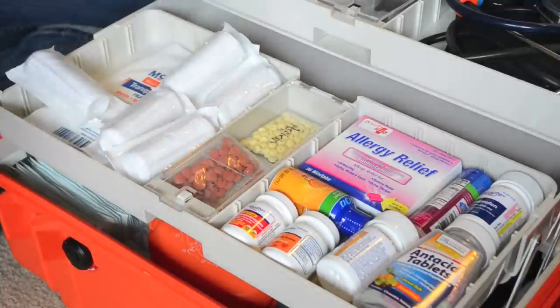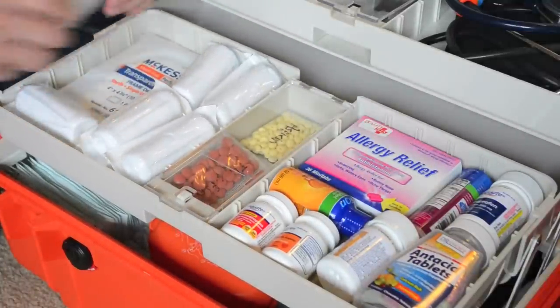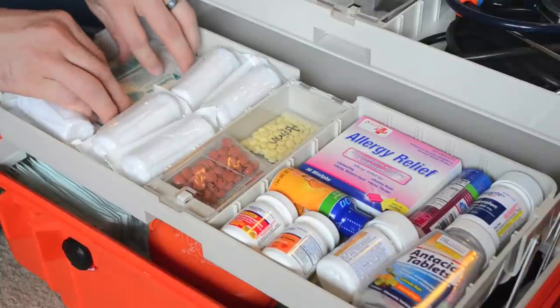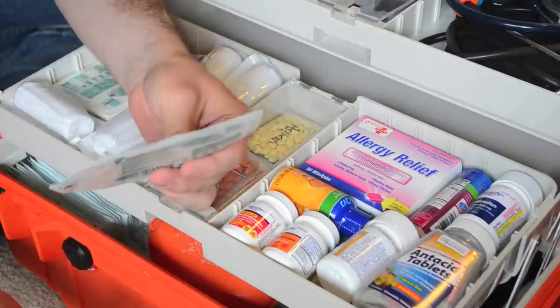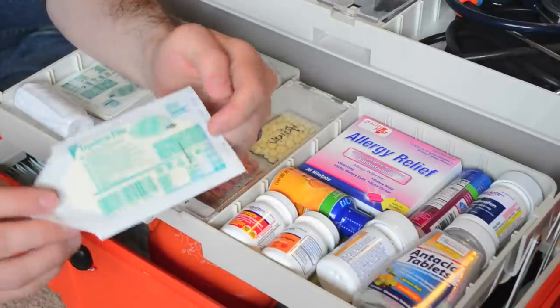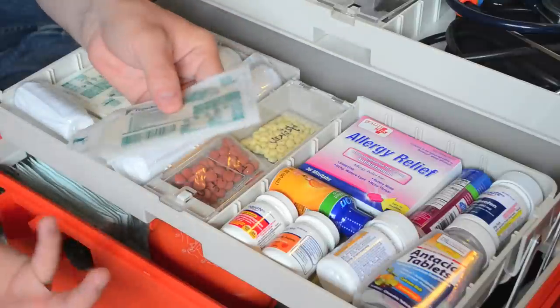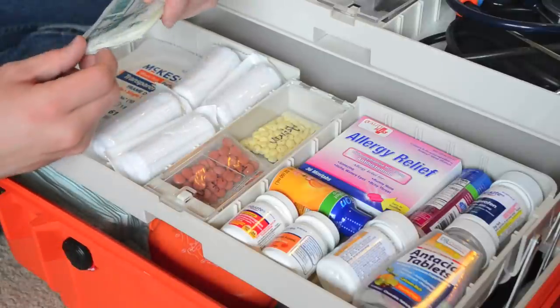This stuff works great for wounds and lacerations — it can be used as an occlusive dressing. A couple months ago I had a cut on my belly. After I got it to stop bleeding, I applied the Tegaderm. That's how I dressed the wound to keep it clean and dry. This stuff is just fantastic, and you can get it on eBay or Amazon for a relatively decent price.